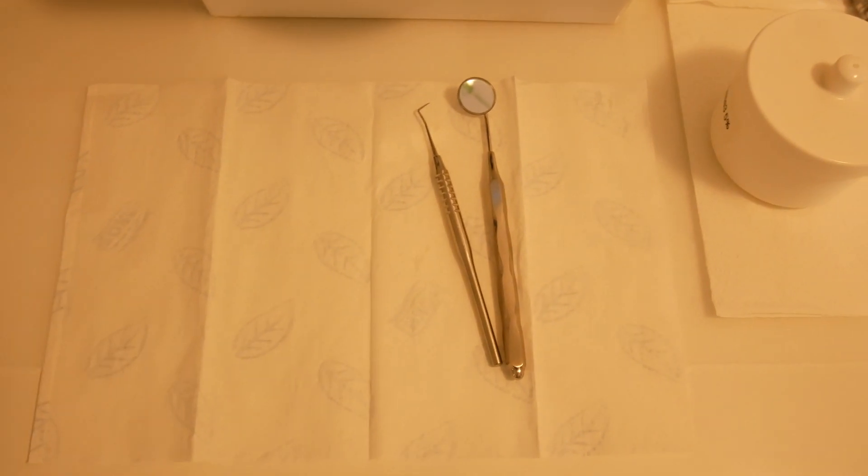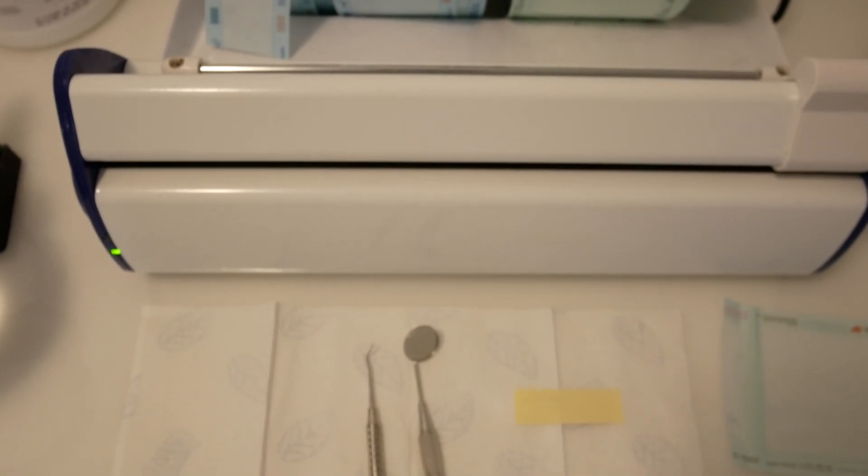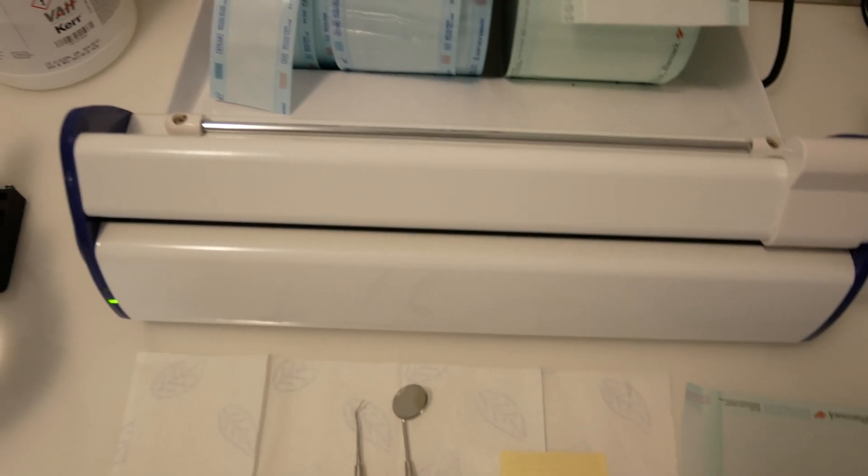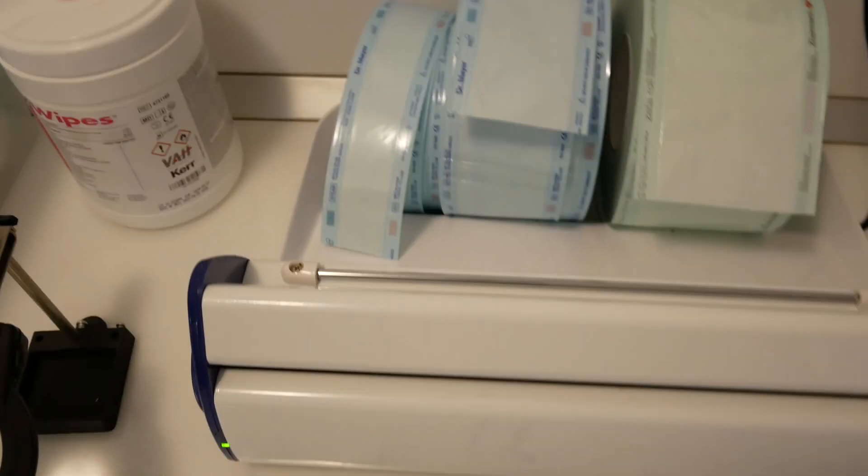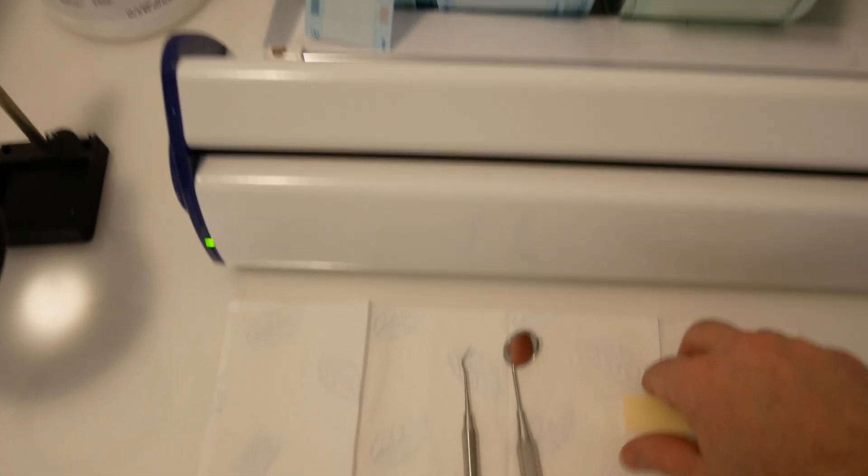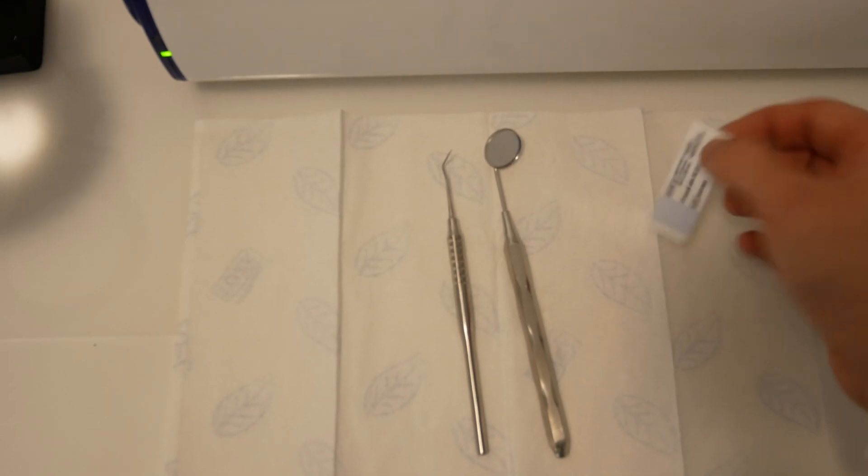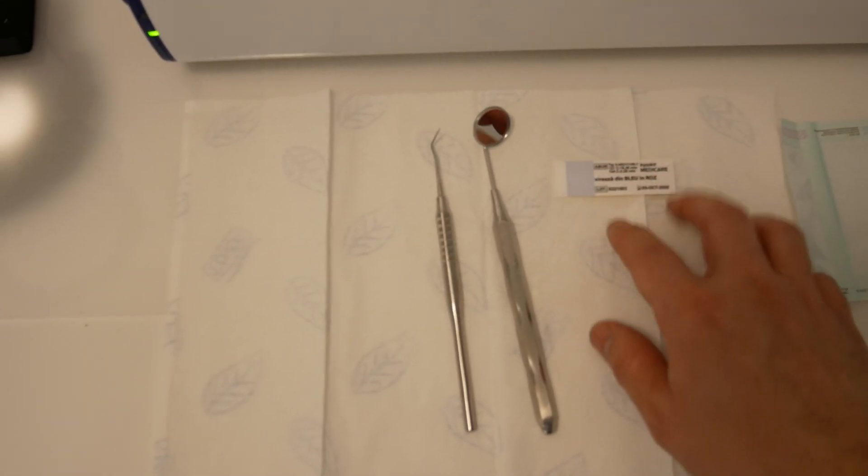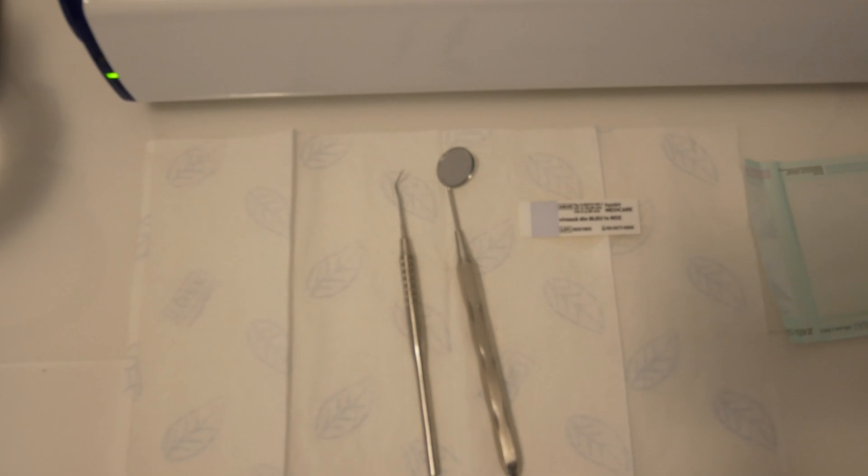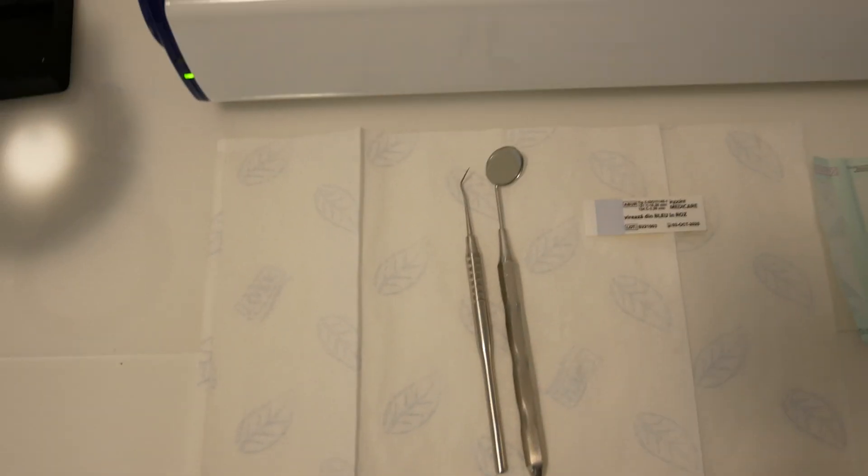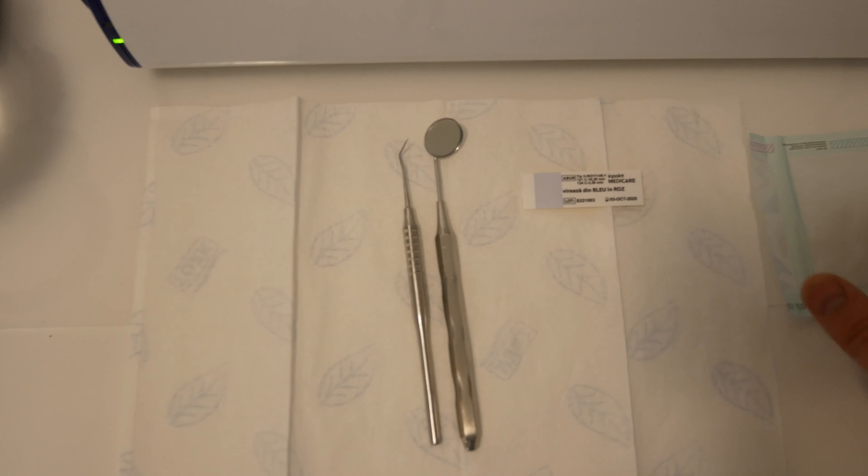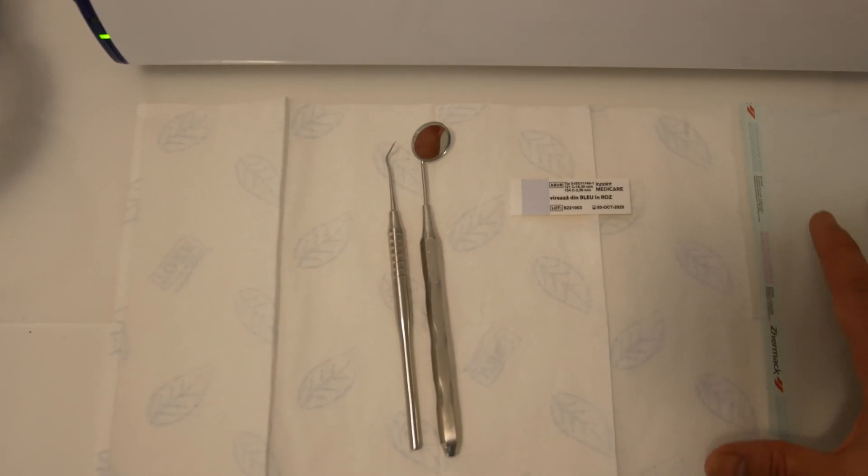Now we can package the instruments. For packaging, I'm using a normal dental sealer with pouches on a roll. I'm inserting in each and every package a class 5 steam sterilization marker. This will show me that the inside of the bag has been sterilized.